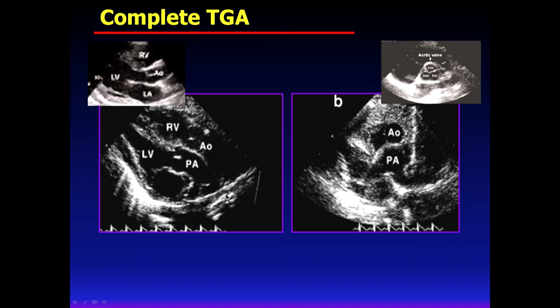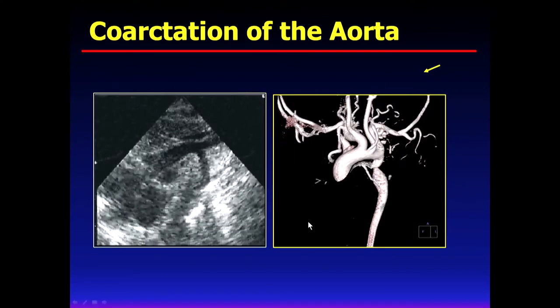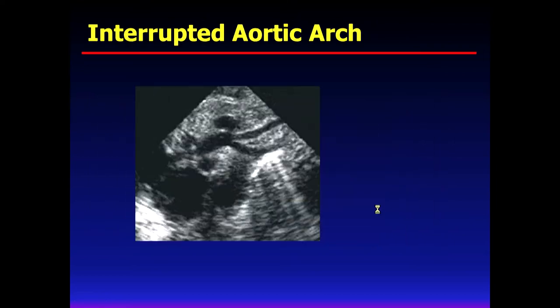So all the time, in this kind of long axis view, we have to think about transposition of the great arteries. And in short axis view, the aorta is located much more anteriorly than the pulmonary artery. In coarctation of the aorta, this time a great vessel, notice the small portion in the aorta, like this; this is an MRI view. An interrupted aortic arch is like this, just interrupted, and here probably some collateral arteries are shown. We can notice where the real descending aorta is, and we need to find how long the interrupted segment is.